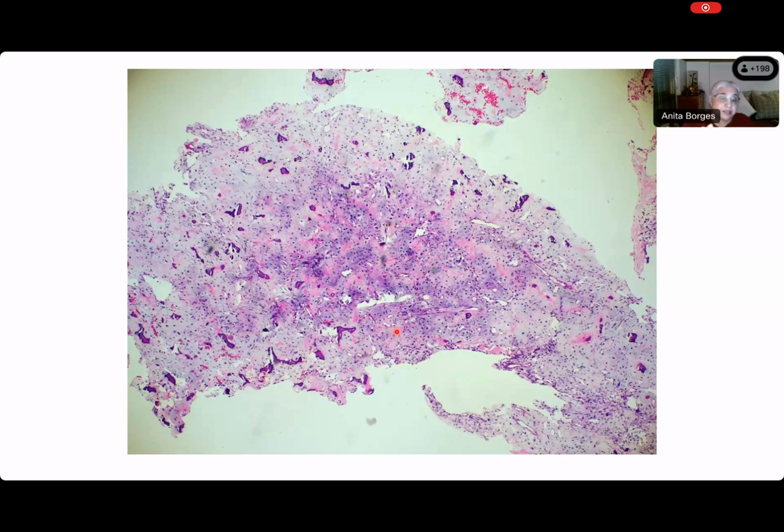And why do we have to make this definition so stringent? Because you can have material that is inside a space that looks like a lumen, but is not a true lumen. It is actually an extracellular space. And do you know which tumor you have a lot of confusion with? Where you have a tumor and you have spaces that look like they are glands, but they are not glands. In fact, we use the "-oid" term. That is an adenoid cystic carcinoma.